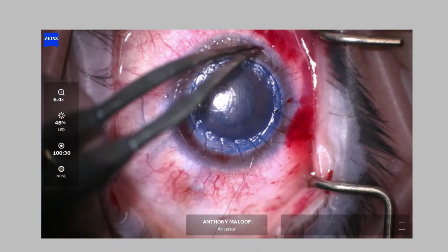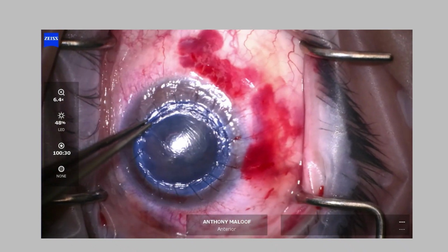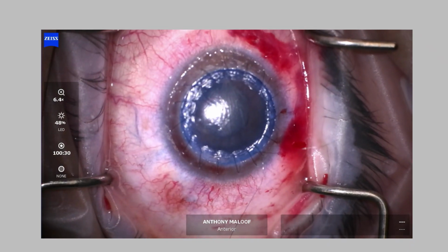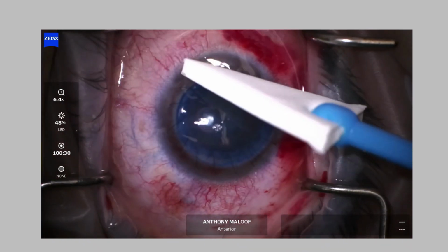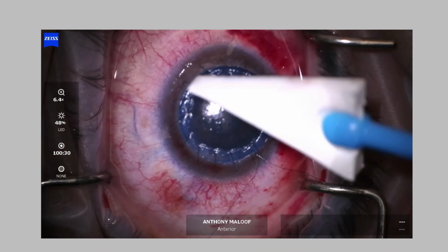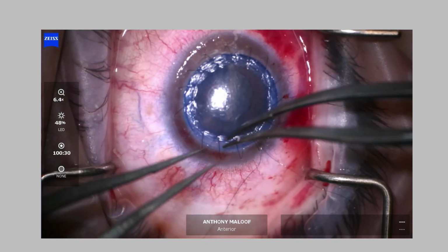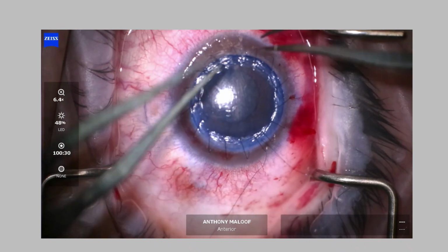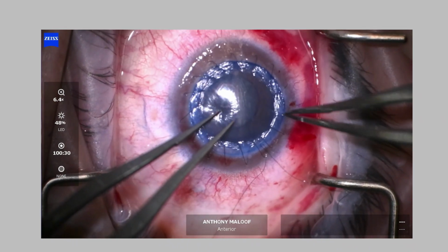So once you do that, here's the next bit. Wiggle. Wiggle the graft. Let it find its place. Don't just leave it there. Wiggle it. Now you can retension it and then close. So I've wiggled it so it has that beautiful cartwheel appearance. Now I retension the suture. There we go. Now I tie it off.